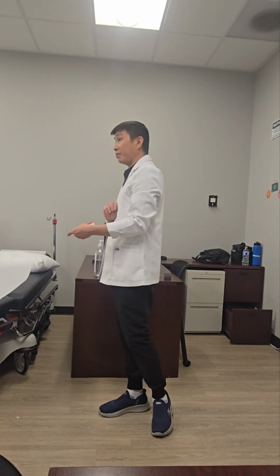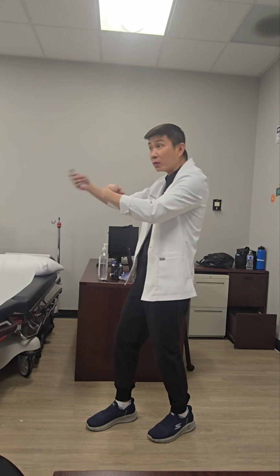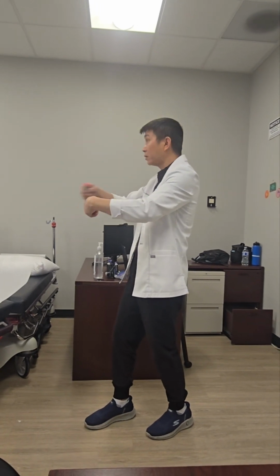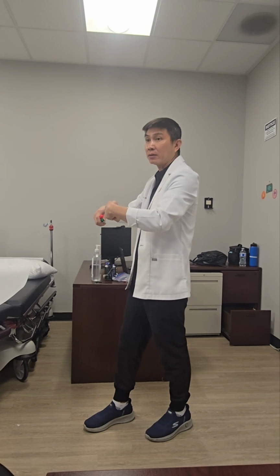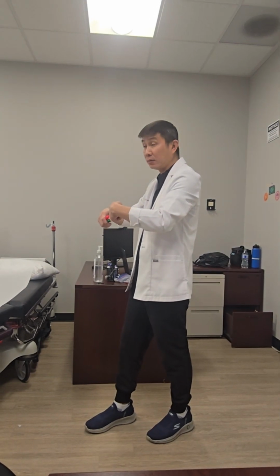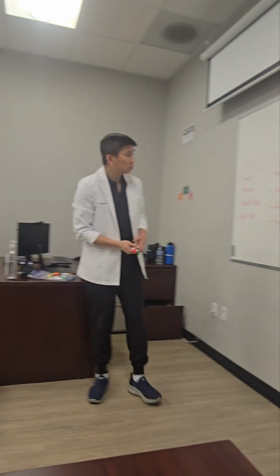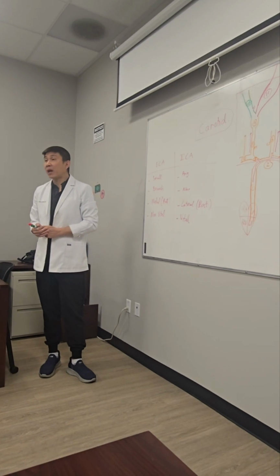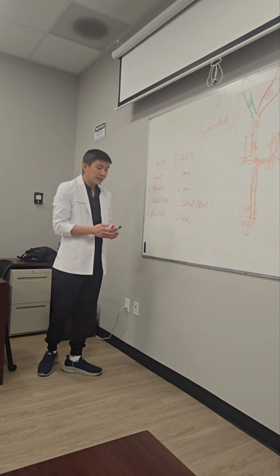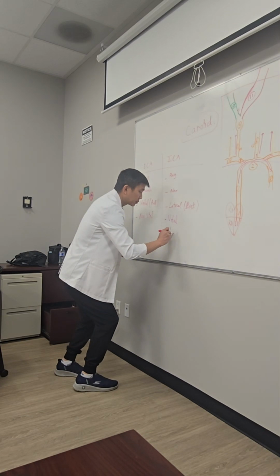Non-resistant, low resistance, because it doesn't resist the blood. Come, I need you, 24/7. Just 3 minutes without you, I'm done. That's the real thing: your brain, 3 minutes, dead. So we can conclude the blood flow for the ICA is low resistance.